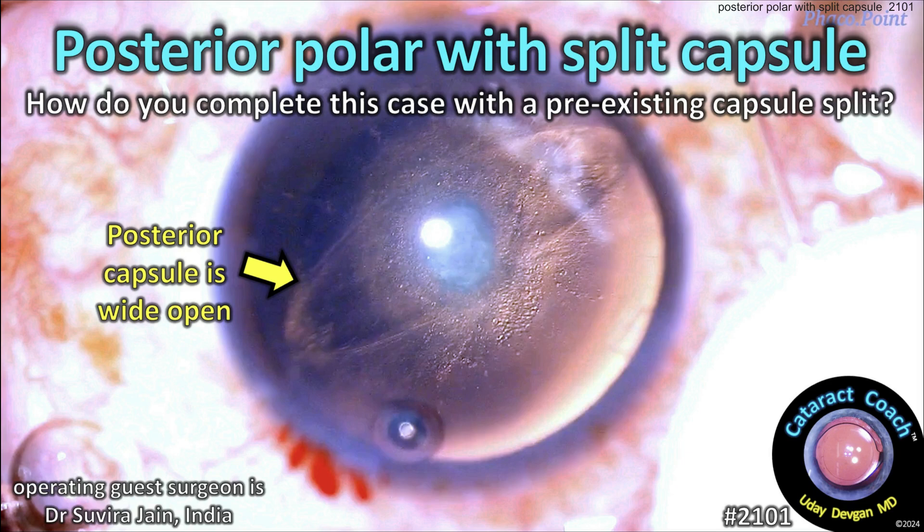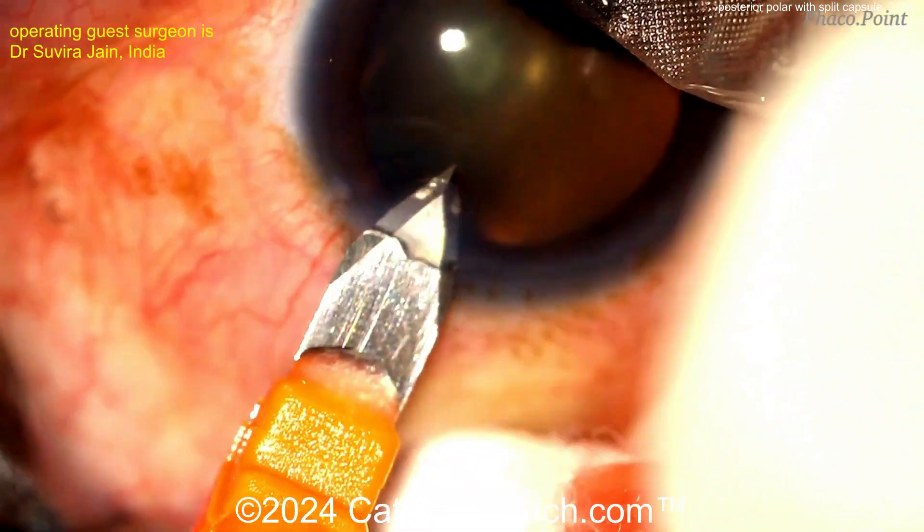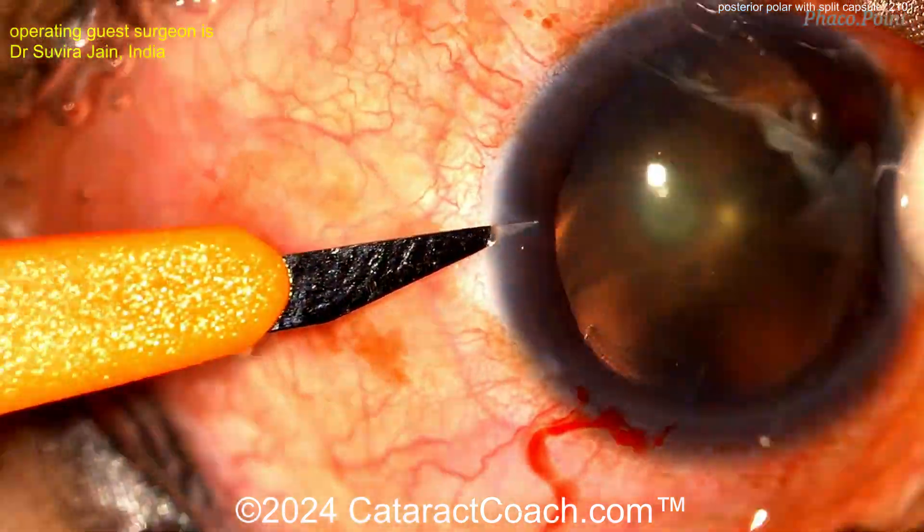cataractcoach.com. Posterior polar with a split capsule — how do you complete this case with a pre-existing capsule split? This is a tough one. Our guest surgeon is Dr. Safira Jain from Mumbai, and she has a nice phaco channel called Faco Point on YouTube. Check it out.